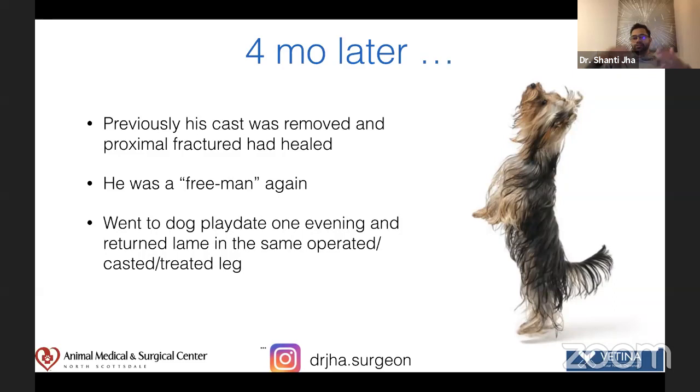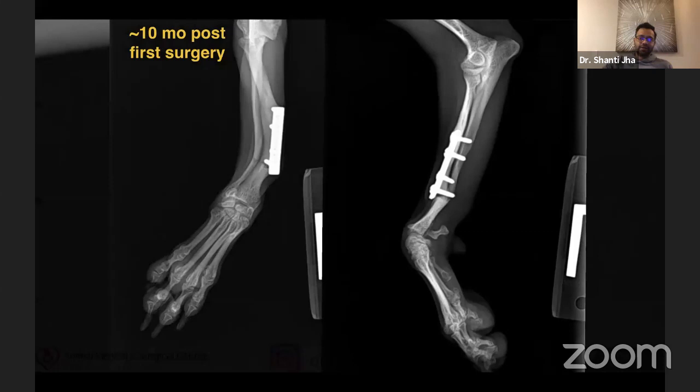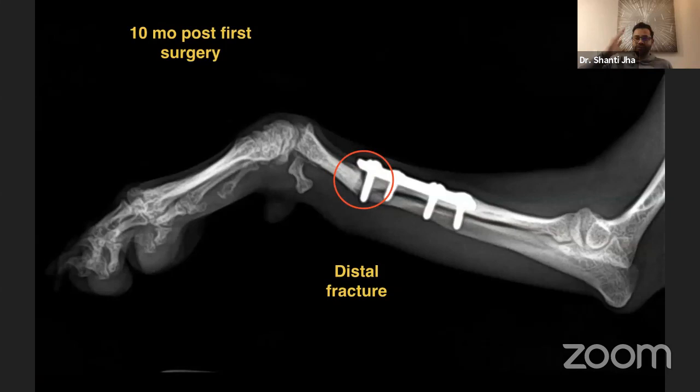He goes to a play date one evening and then returns home with lameness in the same operated leg. Not good. It's too much jumping, I guess. So this is now 10 months post the first surgery, the second intervention where the casting was done. So here is the fracture. Previously, it was a proximal fracture. Now it's a distal fracture.